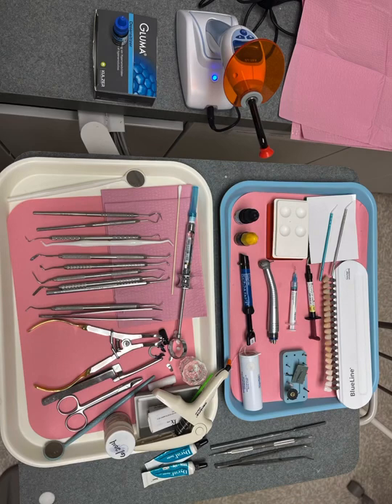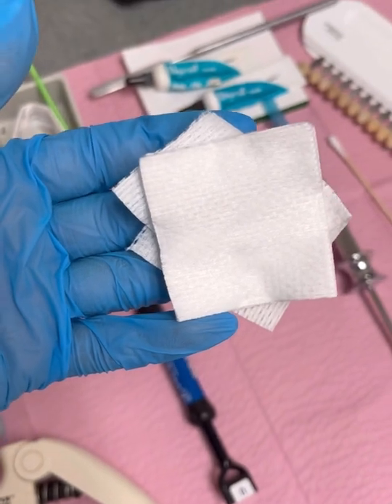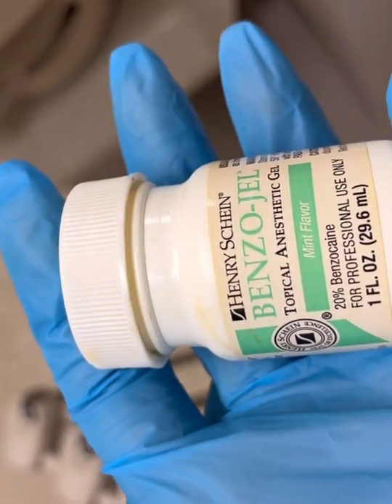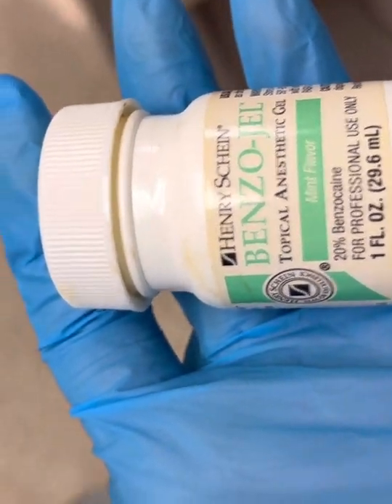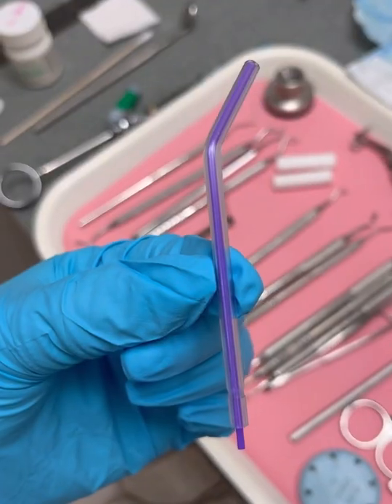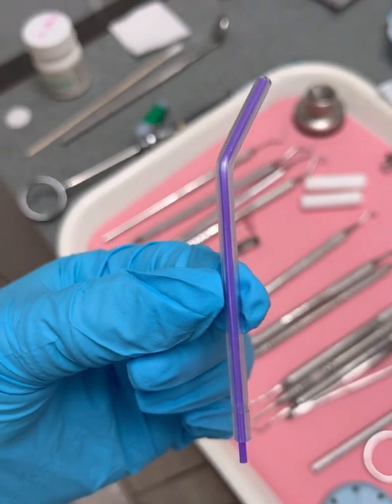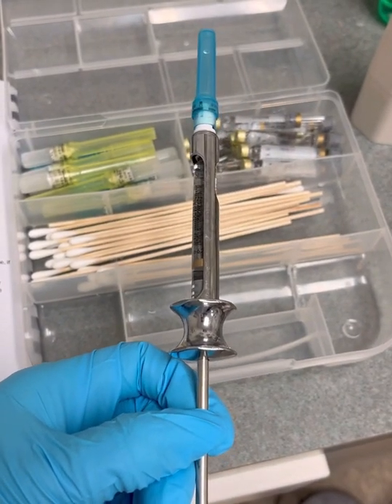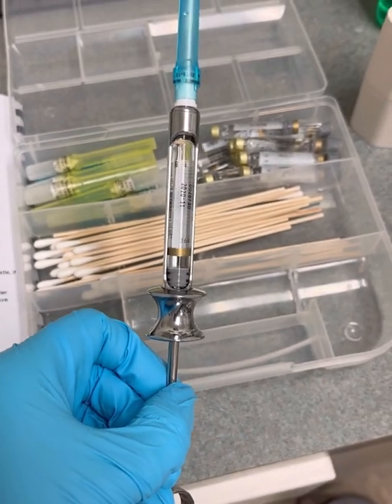I will now go through the composite procedure in order. You will then wipe the area with a 2x2 gauze. You will place the topical anesthetic with a cotton swab. You will then rinse and aspirate the patient's mouth. You will then assist with the local anesthetic and rinse and aspirate the patient's mouth once more.